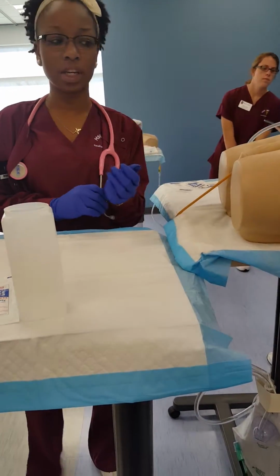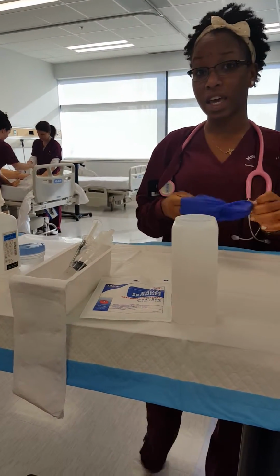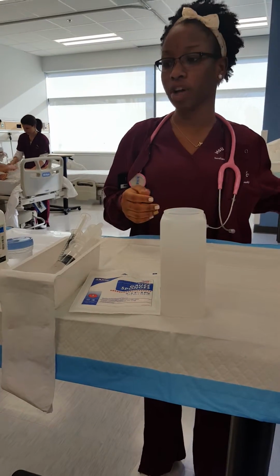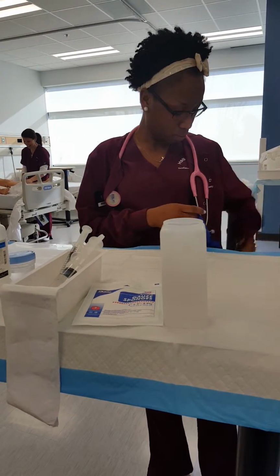And just proper cleaning. I'm going to take this glove off, wash my hands again and put on my sterile glove, because this has to be a sterile practice.